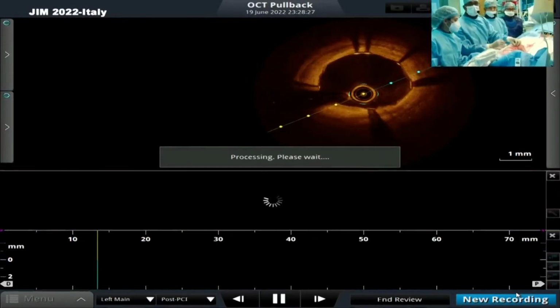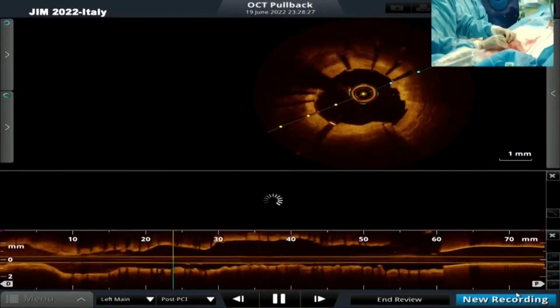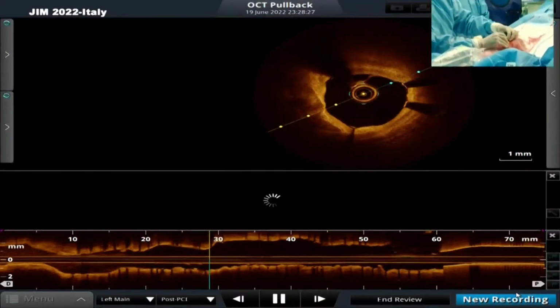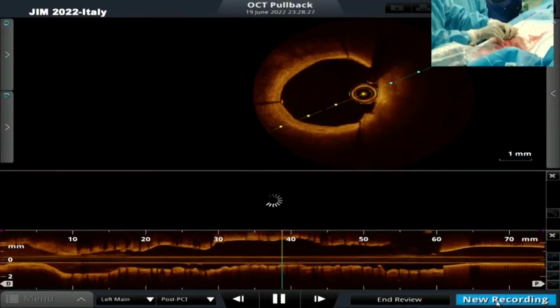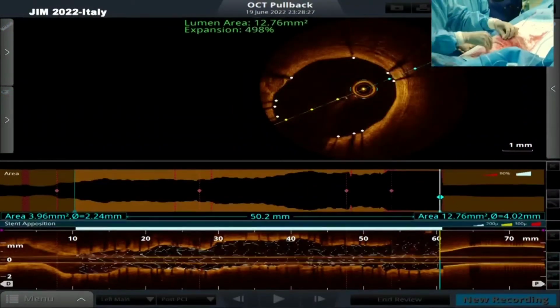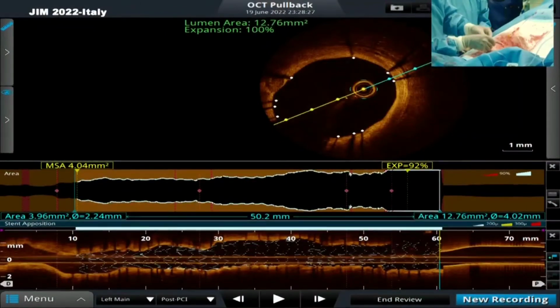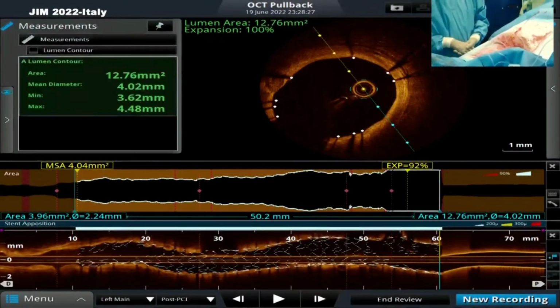It was all good. Tremendous circular expansion pretty much everywhere. There's some minor protrusions here and there. What can you do about those? This is just the great and a very nice tapering. Okay, well, I'll come to that.